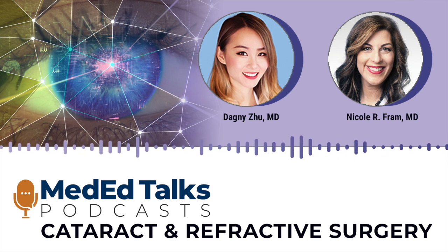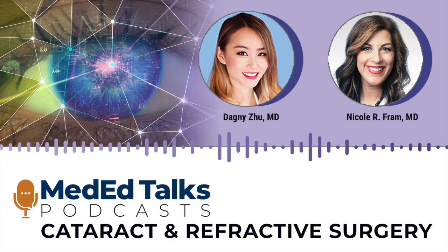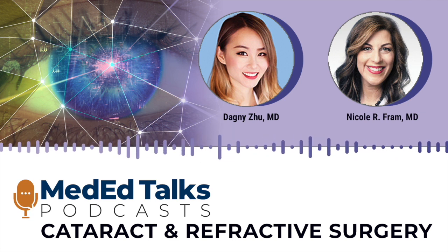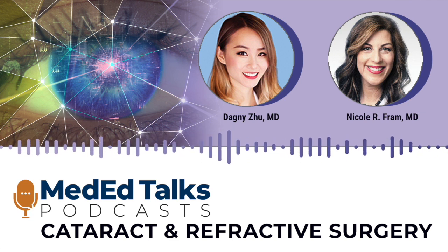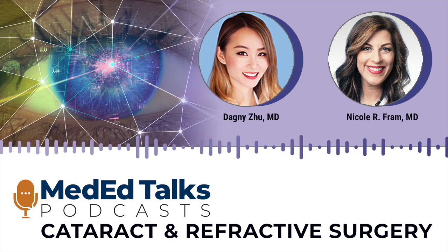And I feel so good when I have scleral vessels that are saying the same thing as the iris registration, right? My big issue with digital marking and things not registering is that the person that did my biometry data didn't send over the reference image. It's not what's happening in the OR.